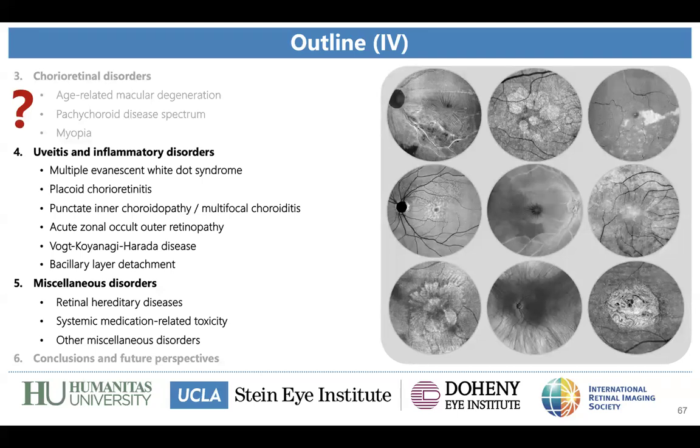It is important because here in Brazil we don't have the medication for atrophy yet. But we are used to following those patients through B-scan and FAF. I've read some papers showing that FAF, like you said, is very similar to en face OCT, which I don't completely agree with, because en face OCT is better when you have media opacities, and when the atrophy is close to the fovea in the FAF, the fovea is dark.